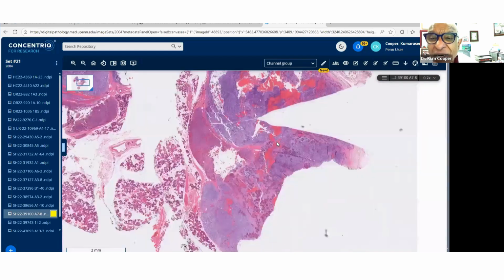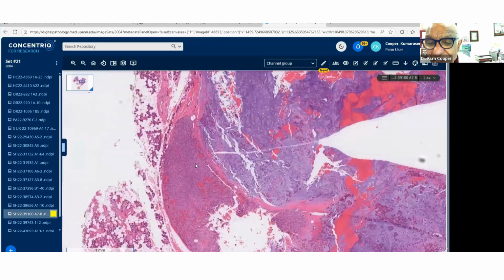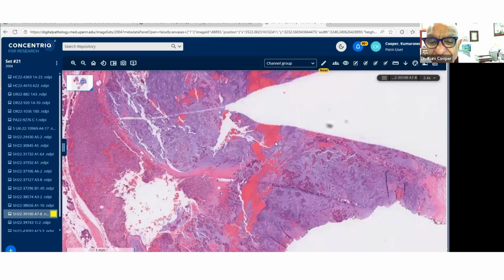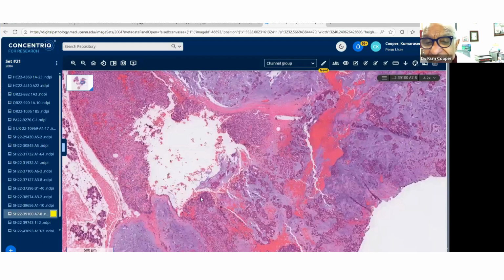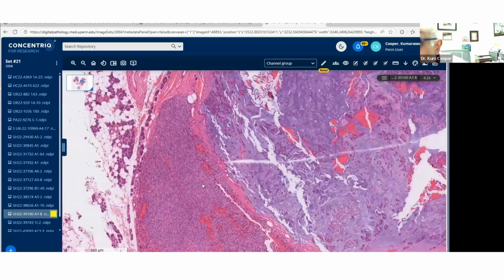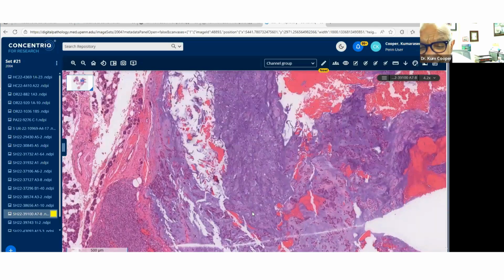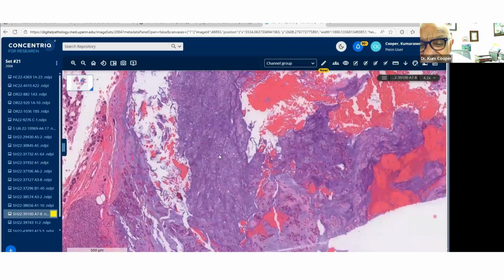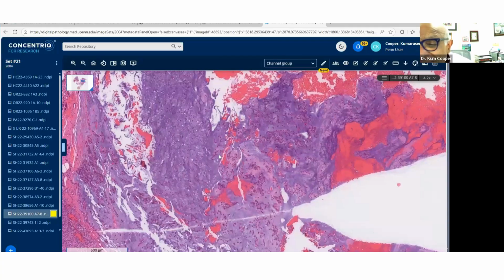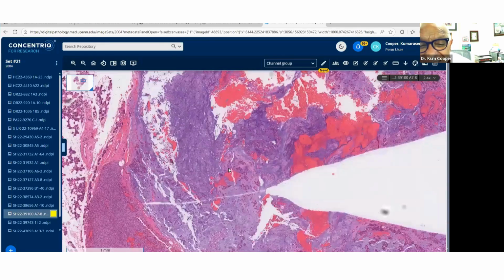All right, back down to low power. Okay, there's a defect here. And let's follow the capsule. Follow the capsule. And here you can see this just breaking out here. So same tumor breaking out and giving rise to this component. So there we go, myoepithelial neoplasm. I love that. And that's what this is. This is myoepithelioma, just based on the mesenchymal type matrix. And then the cords and strands, and we talked about the myoepithelial markers earlier.